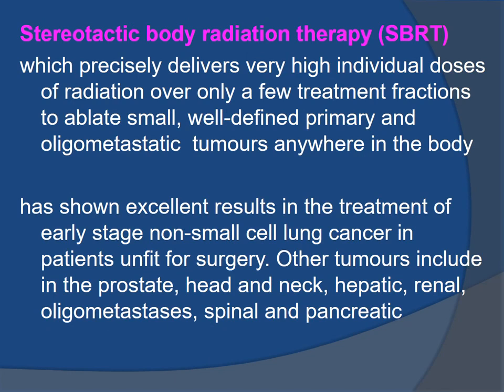Stereotactic body radiation therapy. This is another technique for the radiotherapy, which precisely delivers very high individual doses of radiation over only a few treatment fractions to ablate small, well-defined primary and oligometastatic tumors anywhere in the body. This has shown excellent results in the treatment of early-stage non-small cell lung cancer in patients unfit for surgery. Other tumors include prostate cancer, head and neck cancer, hepatic and renal cancer, oligometastasis, spinal and pancreatic tumors.